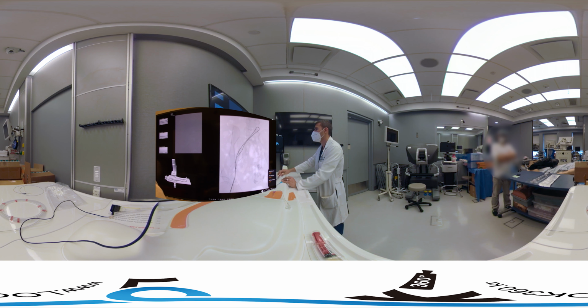A little injection. You can see that it comes off right where we're at that branch point right there. So we're just going to come off just a little bit. Now it should come off laterally here, based on what we see on the angio. So we're going to try to select it again, manipulating the microcatheter and the micro wire.